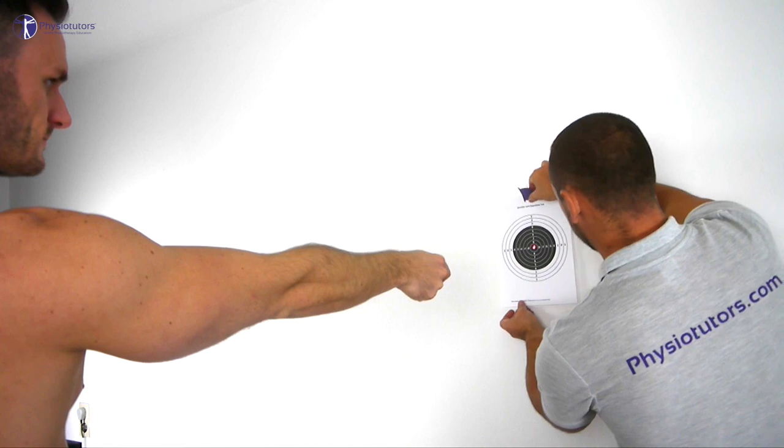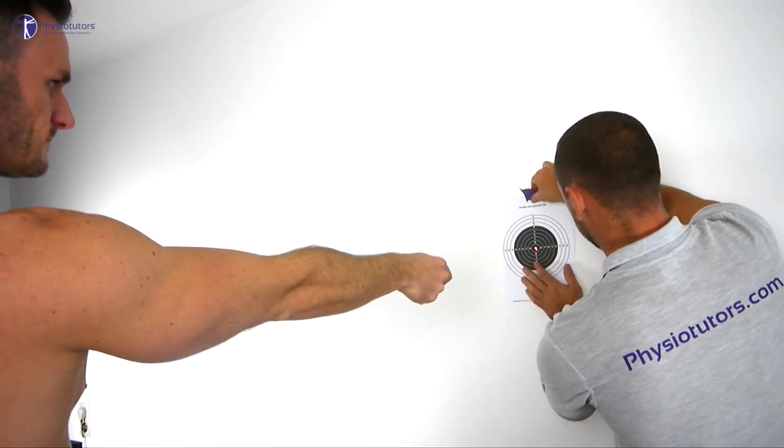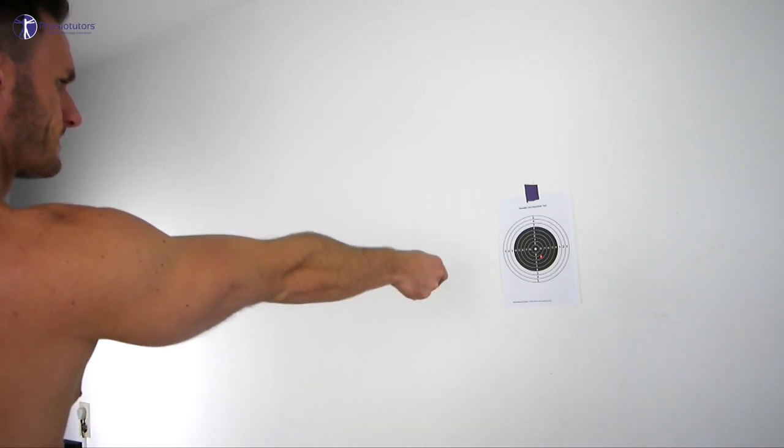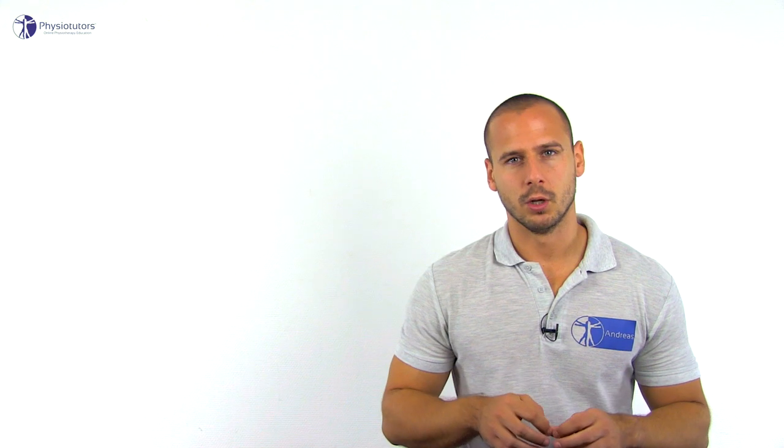Attach the scoreboard to the wall so that the center is aligned with the laser pointer. We will assess flexion, abduction, and returning from external rotation. The patient is then allowed three practice rounds with eyes open. The fourth attempt is done with the eyes closed and you will record their score.